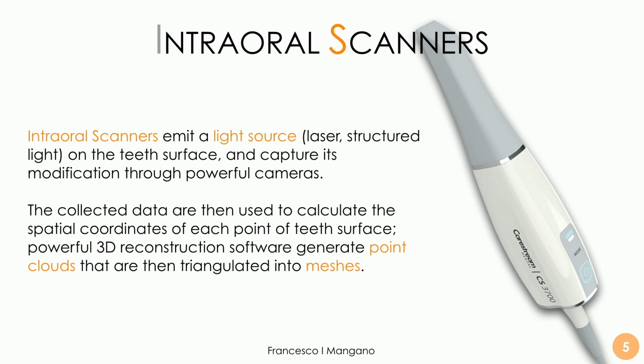What is an intraoral scanner? As I told you before, it's a very powerful device that emits a light source, usually a structured light grid. This grid impacts on the teeth surface, and the scanner is capable of capturing the modification this structured light grid undergoes through powerful cameras, and then these cameras send all the information to the software.